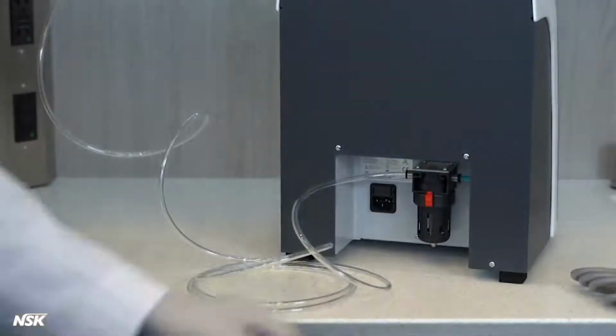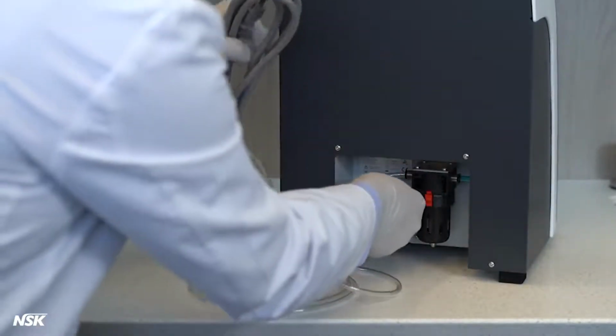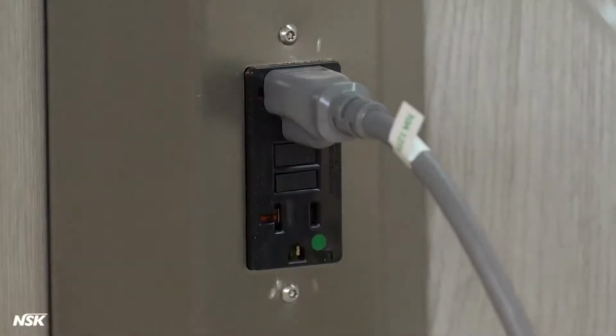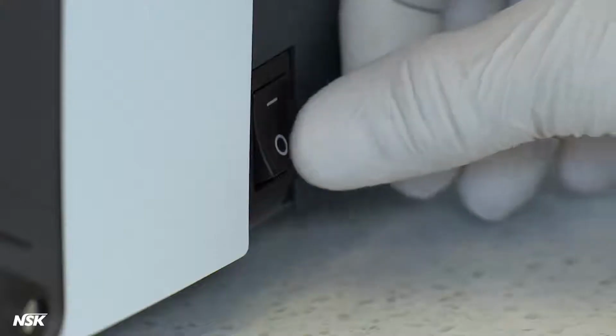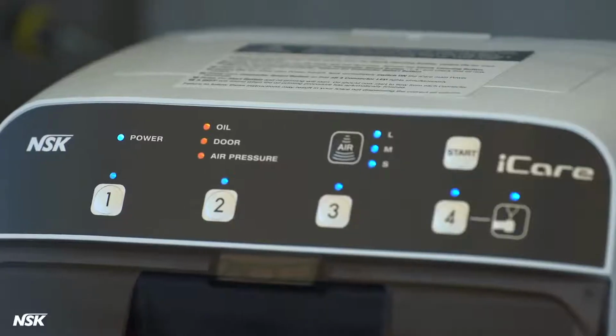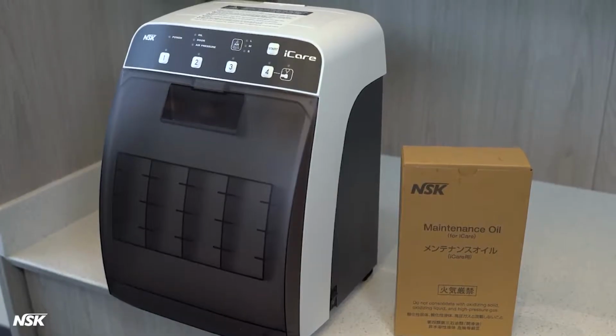Now it's time to connect the power cord. Insert the connector to the back of the iCare unit first, and then plug the power into a wall outlet. Test the power by switching the power on and then off. You should see lights on the display. Now, let's fill the oil tank with maintenance oil.